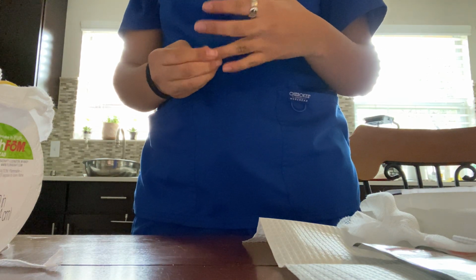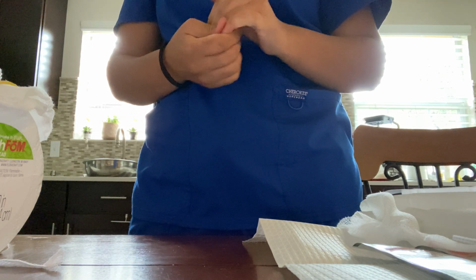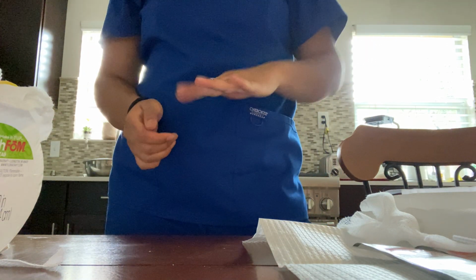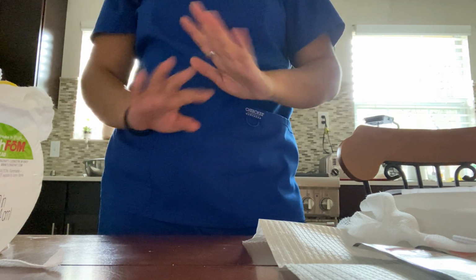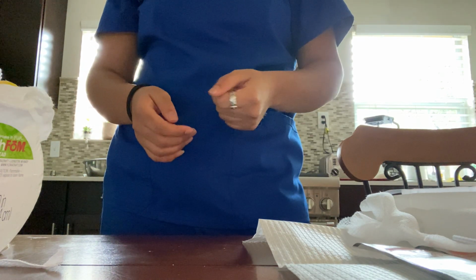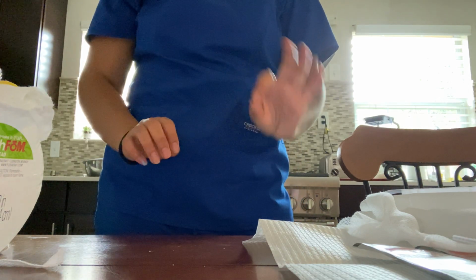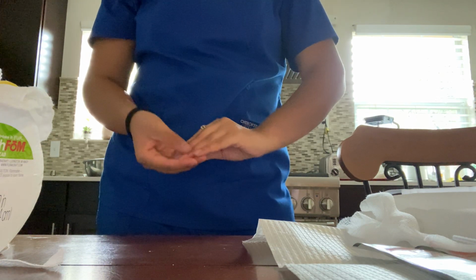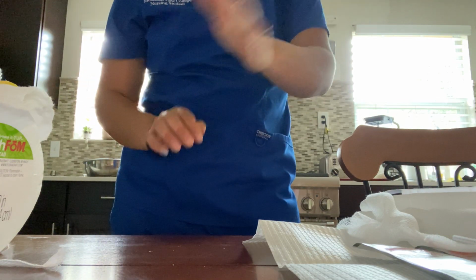And then after you perform your hand hygiene and dispose of the gloves, you will document everything: that the patient's bed is in a low position, everything, your trach care, all of it. So you want to just document everything. And yes, after that, we are done. We maintained sterile technique through the whole thing. We did not break it. We verbalized everything that we wanted to. And yes, patient is good. We are good. Thank you so much.